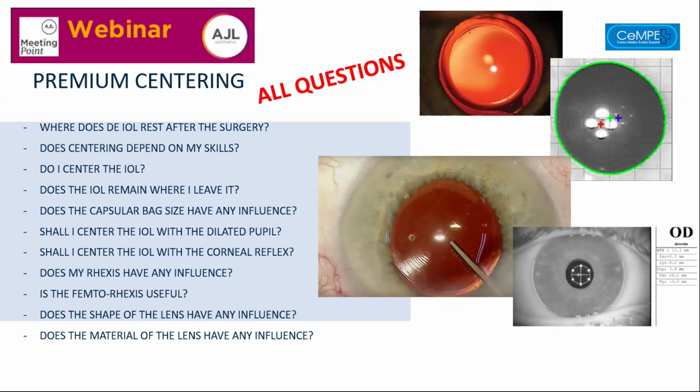So it will stay at the position it wants after the capsular bag starts shrinking. So, in order to get the same result with every implantation, so you can follow your results, by implanting the CTR you ensure this lens is going to remain at the ELP, effective lens position.